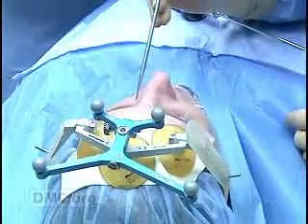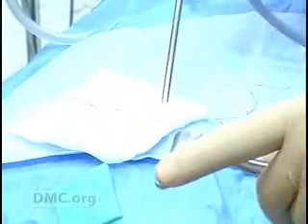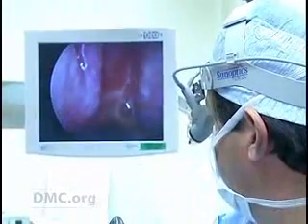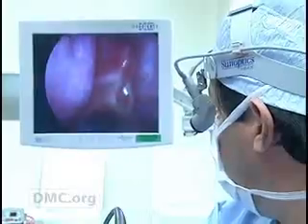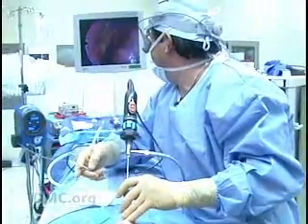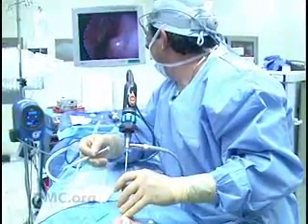With Peggy under general anesthetic, Dr. Yerman first used an endoscope with a tiny camera on the end to check out her nasal passages on a monitor. That's a little bit of infected mucus at the back of the nose. And that's the reason we're doing things. We're going to try and open things up so they drain.